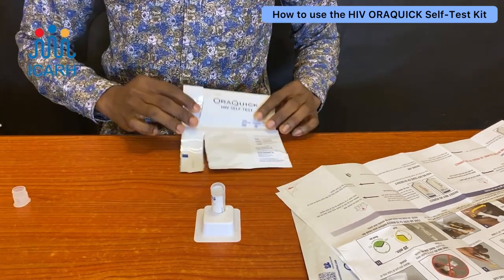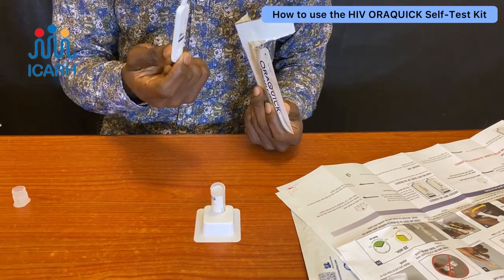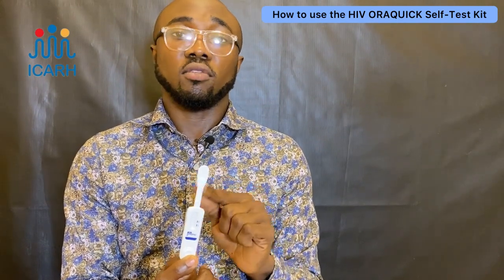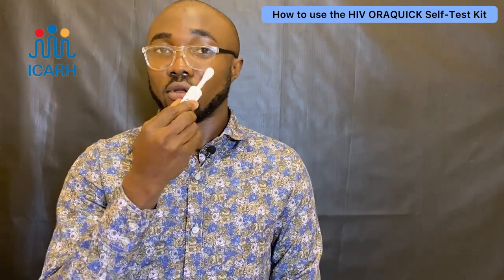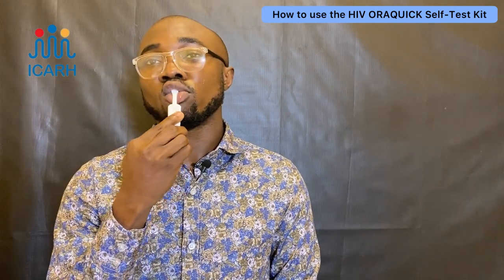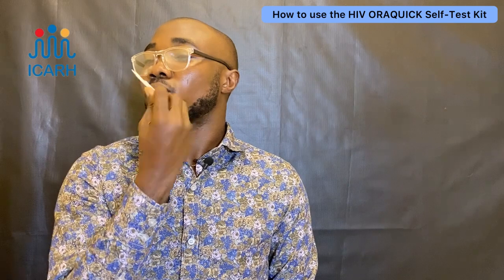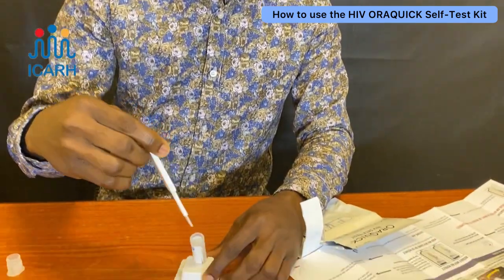Next is the test kit itself — it looks like this. Please make sure you don't touch any of the tip parts, because this is what you'll be putting in your mouth to swab around your gum. All you have to do is swab it around your gum like so. Please don't chew it — it's not edible. Then drop it inside the buffer.